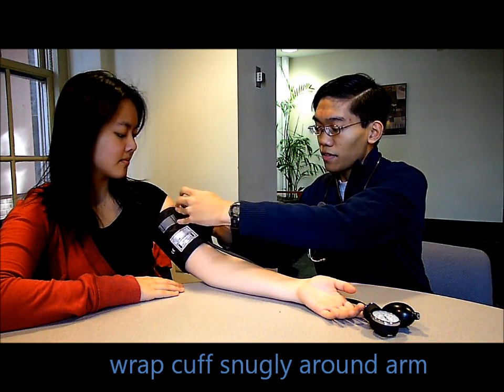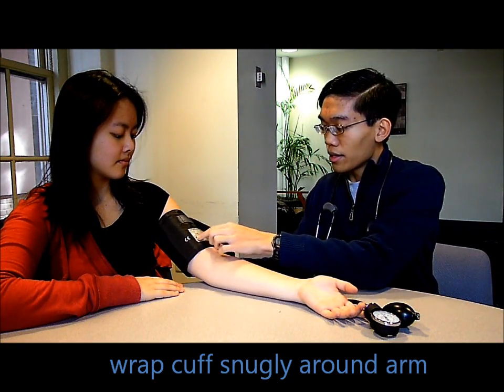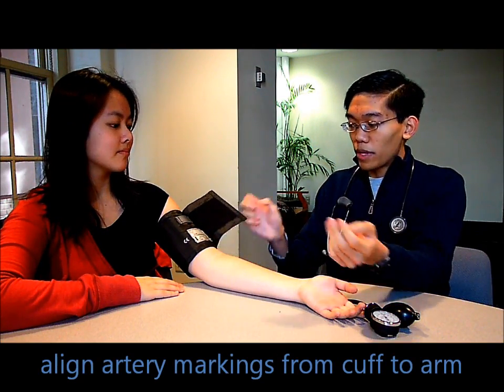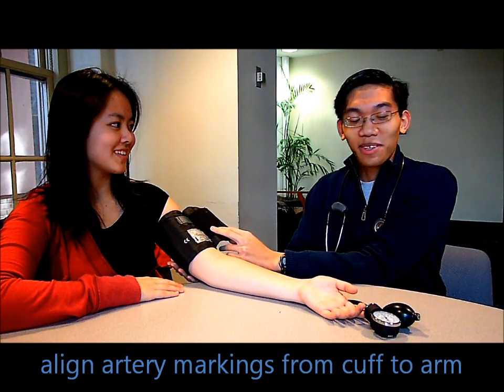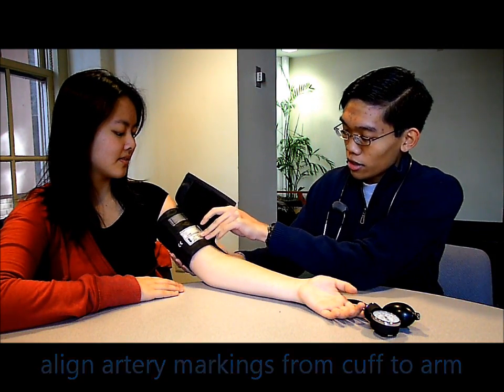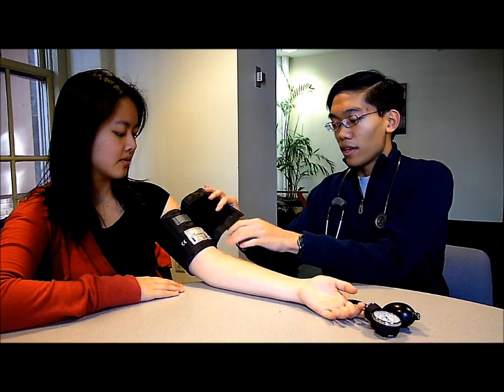tightly enough that the cuff doesn't slide up or down. You want to align the artery markings, depending whether you're using the left arm or the right arm, with the space inside the crease of the elbow a little bit towards the interior aspect of the upper arm. Since we're using the left arm in this case, we want to align the left arrow just inside the interior aspect, just above the crease of the elbow.